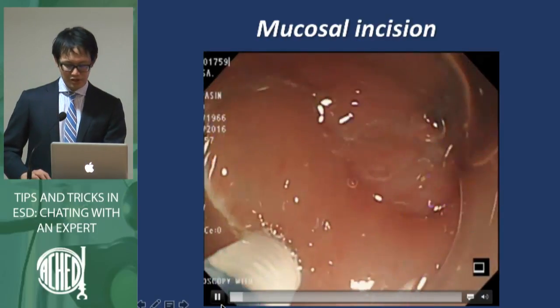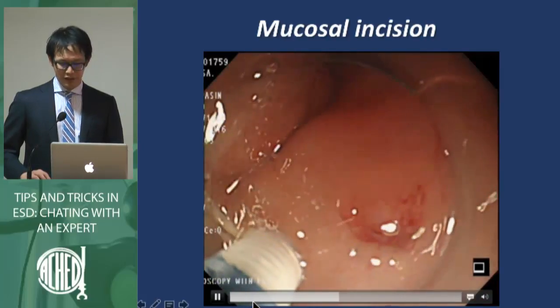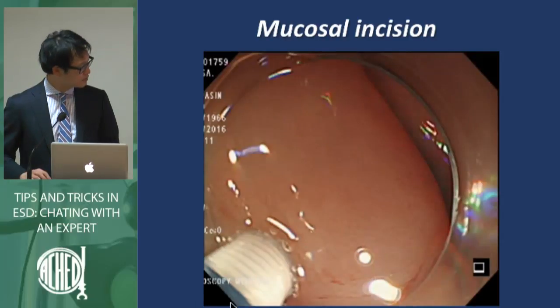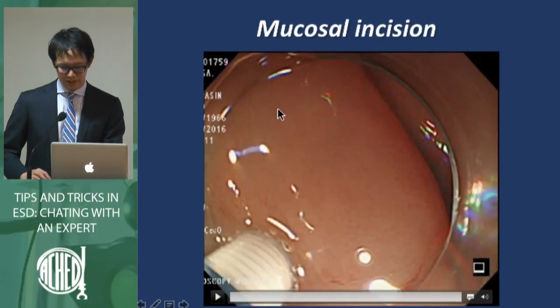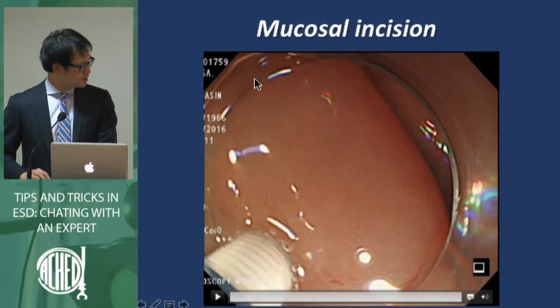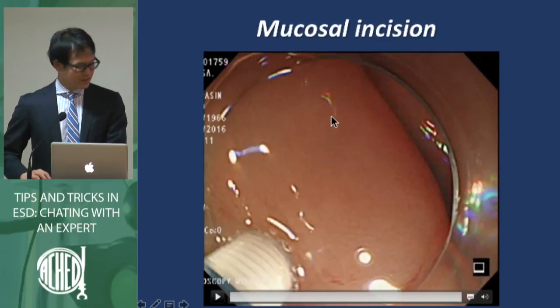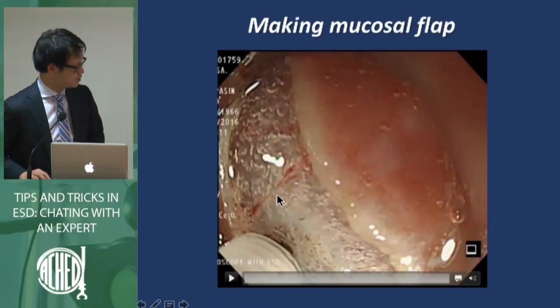Next, I show the video. The mucosal incision line should be 5 to 10 millimeters from the edge of the tumor, because sometimes the pathological report shows a positive horizontal margin. So we usually cut a little bit far, 5 millimeters from the edge of the tumor.